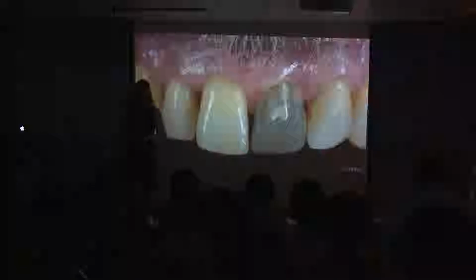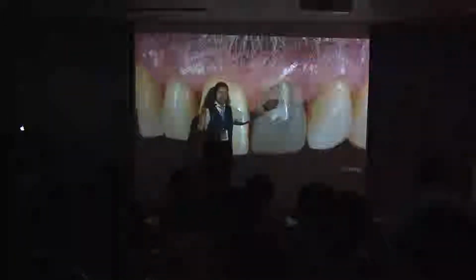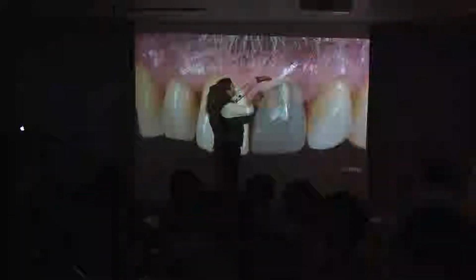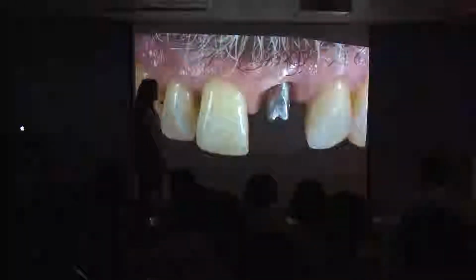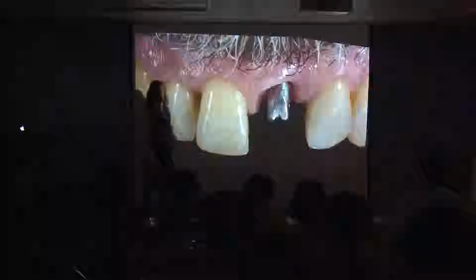I do not have to invade the biologic width. And it's easy to remove the cement, because if you just touch the tissue, you can see the abutment. It's not deep. You can reach it very easily. The tissue is very sharp and well positioned.